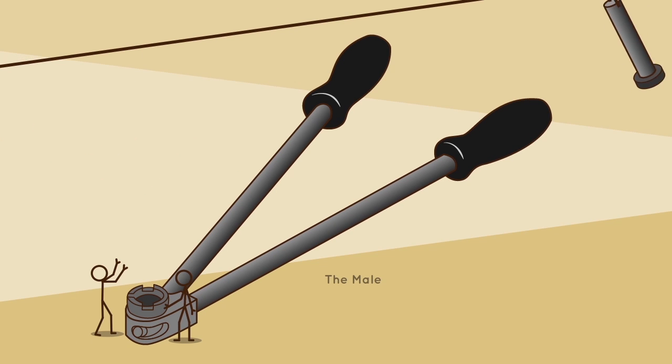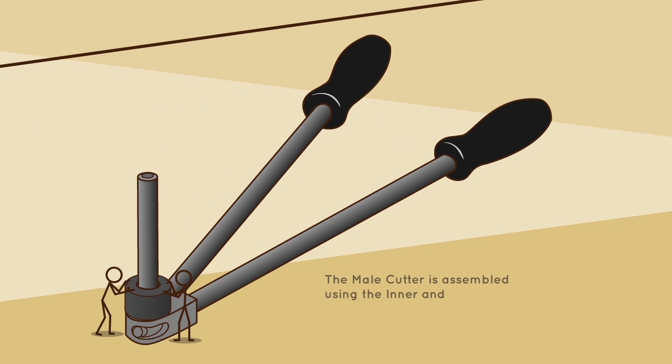Male cutter assembly. The male cutter is assembled using the inner and outer sleeve corresponding to the implant size.